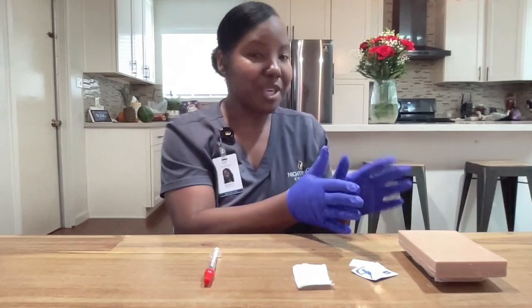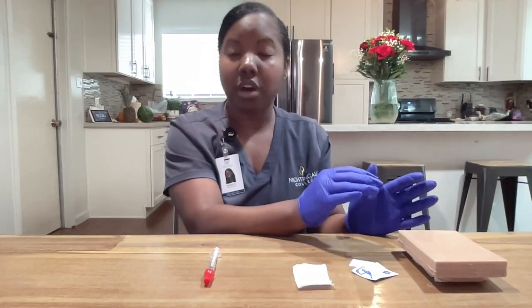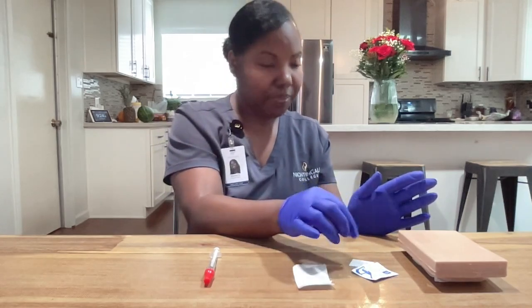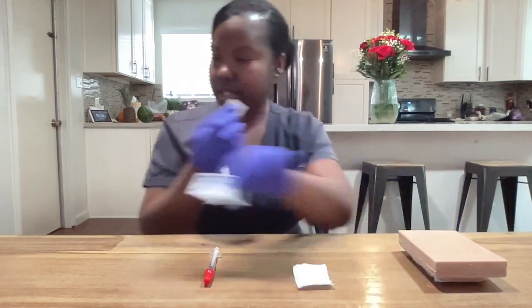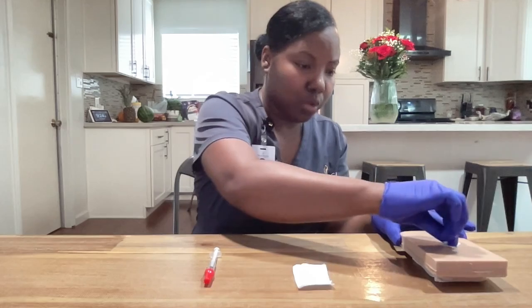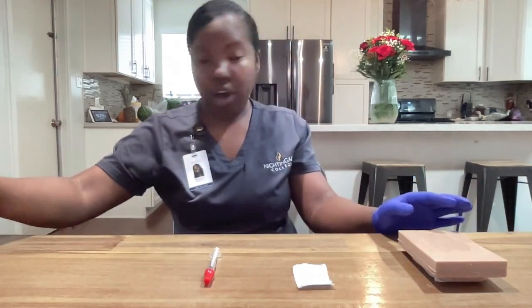Mr. Jones, thank you for giving me your permission to touch you, and everything looks okay. If this was not an appropriate spot, the injection can be done on either forearm, or if neither forearm works, you can also use the upper back area. Mr. Jones, I am going to clean the area now because I'm ready to proceed with the injection. I will get my alcohol swab and clean the site, starting in the center and rotating circularly outward about two inches. I will dispose of the swab and let the alcohol air dry.